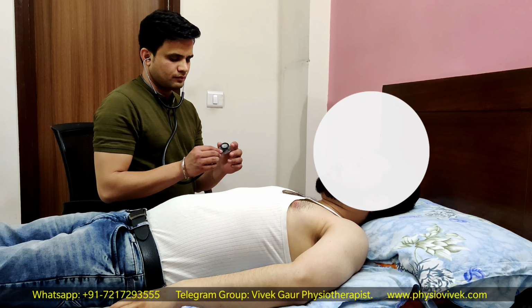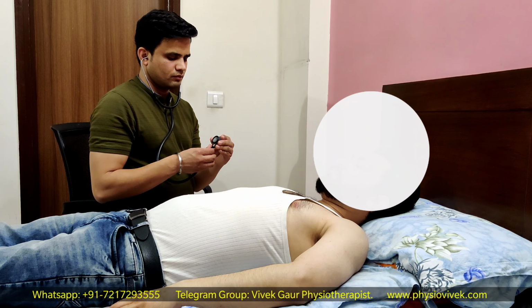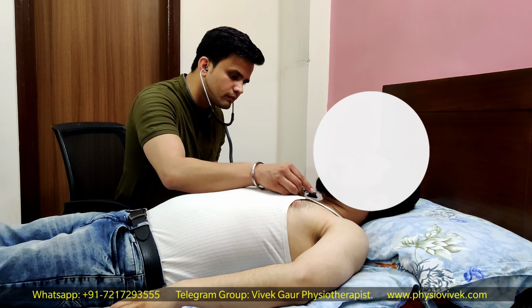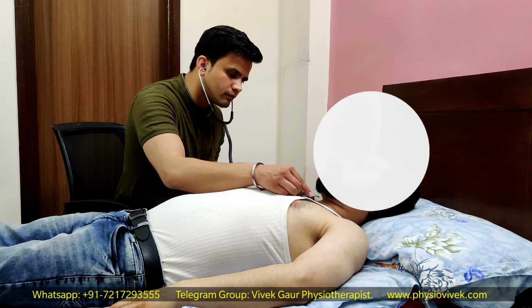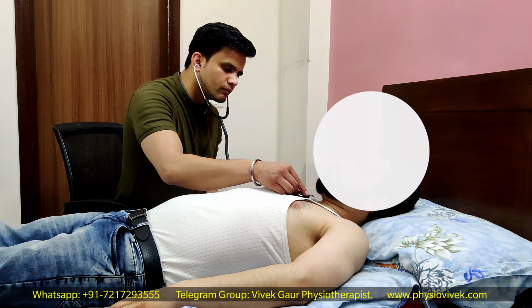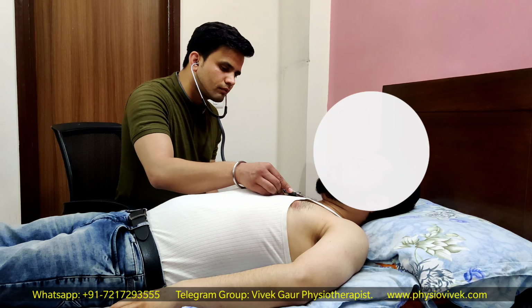Once you have heard the heart sounds clearly with the diaphragm of the stethoscope, now turn around the diaphragm and put the bell of the stethoscope on these respective valvular areas. Make sure you are not pressing too hard on the bell, because then your skin becomes the diaphragm and it starts vibrating. So you are listening to the low pitch sounds, and try not to press too hard with the bell on these valvular areas.